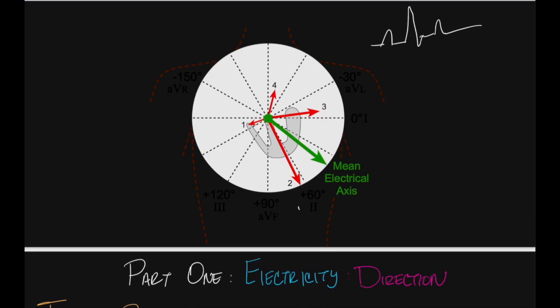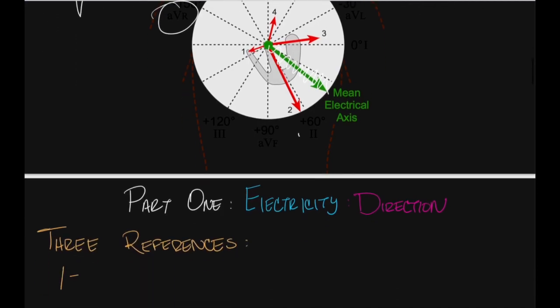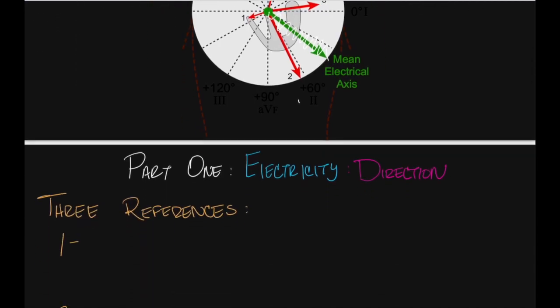And we know that AVR, this typical complex on the 12 lead, is a negative P wave, a negative QRS complex, and a negative T wave. And we notice that the average movement is away from AVR. So we can start to characterize things based off of where the electrical activity is flowing and which lead is looking at that electrical activity.